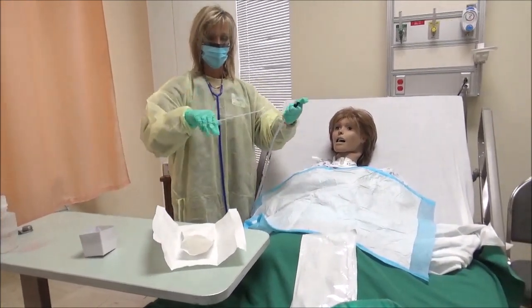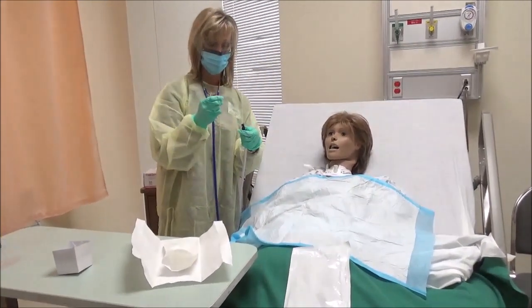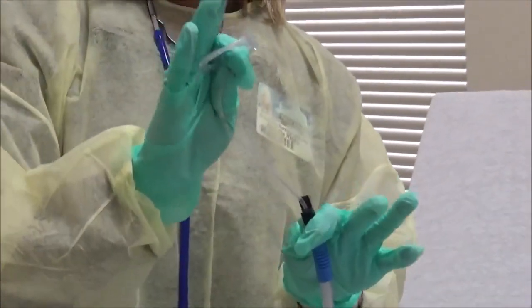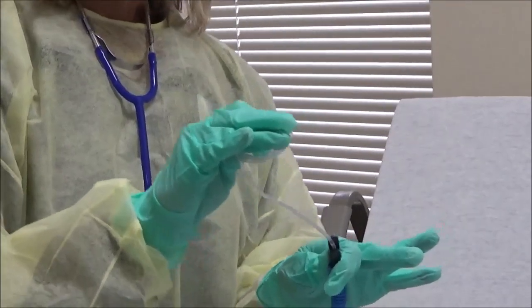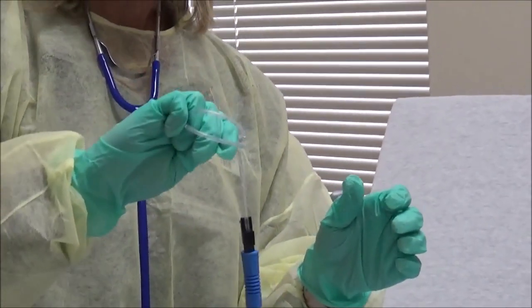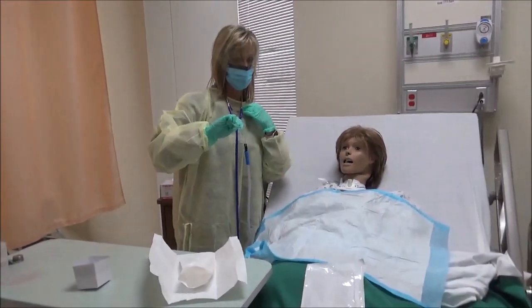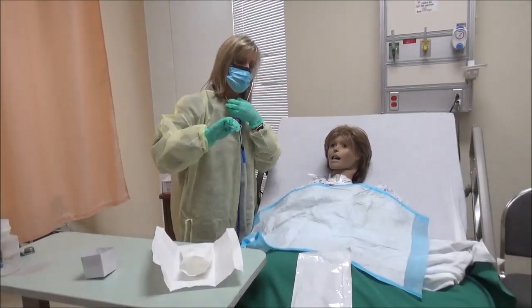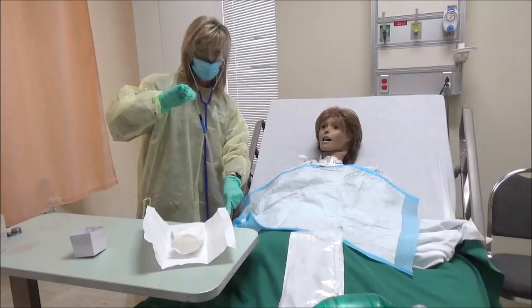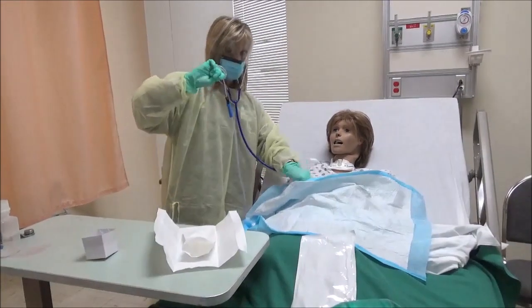Now, I'm going to reassess my client because there's the chance that they may need suctioning again. But remember, my right hand is sterile. My left hand is not. I want to keep this sterile in case I have to go back and resuction. So I'm going to hold that. This is sterile. But now I've got to assess my client with this non-sterile hand. So that's why I left my stethoscope right here, so I can put it on my ears. I'm looking at my client's O2 sat monitor, and I need to listen to their lung sounds again and keep this sterile.